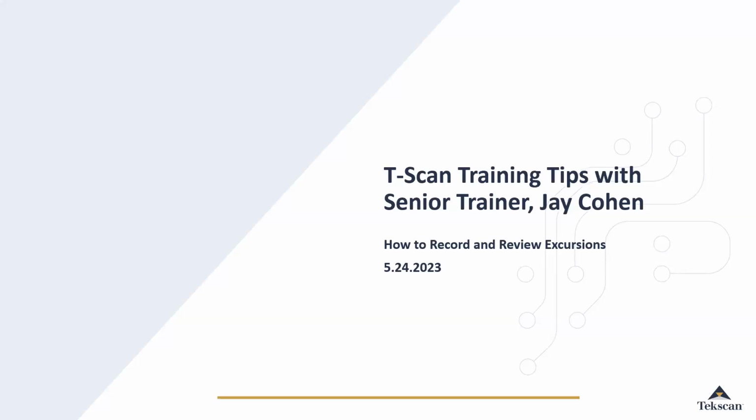Regardless of your philosophy, if you do follow any, the goal for today's webinar is to present the features and functions of the Tekscan that allow you to see and treat the occlusion dynamically, unlike static methods like articulation paper and waxes. And just to mention a little thing about papers and waxes, we don't eliminate or replace articulating papers. They're complementary products. We still use articulating paper, but we use it for really what it's meant to do, and that is just to mark teeth. It's a static means for marking teeth, and it doesn't give us any dynamic information, relative force or timing.